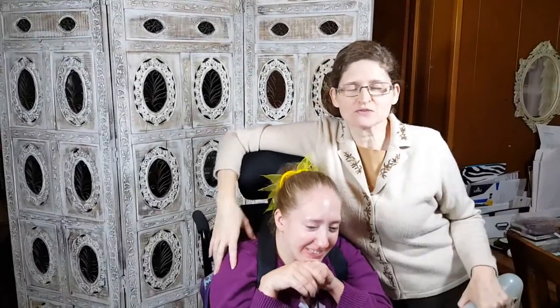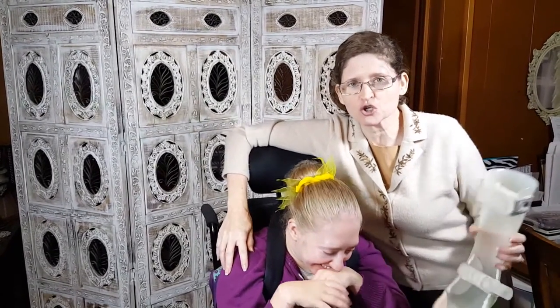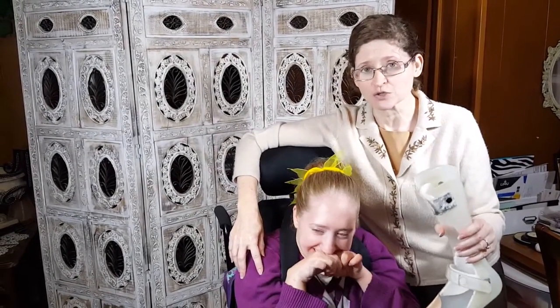Hello, this is Tamara Weeks with Micah Weeks on Tam's Daily Vlog, and we're going to show you Micah's AFOs, how they work, and show you her new shoes and her old shoes and why we had to replace them.